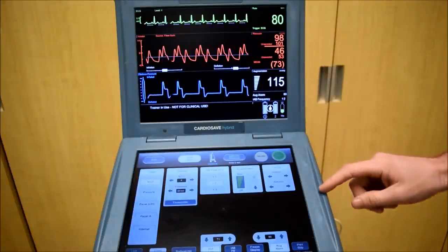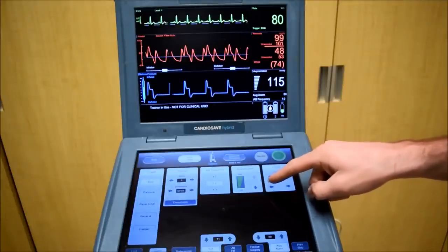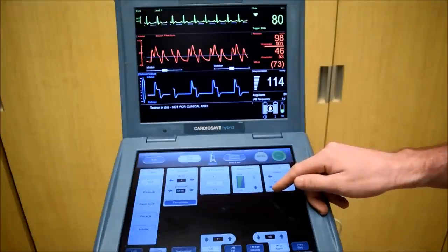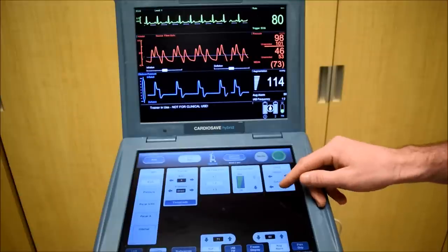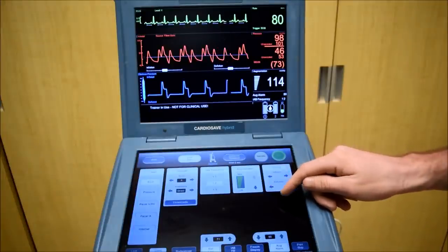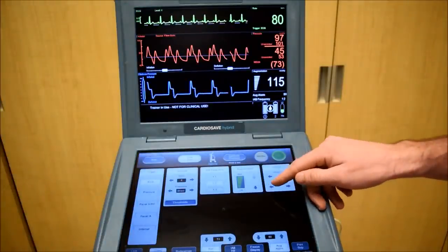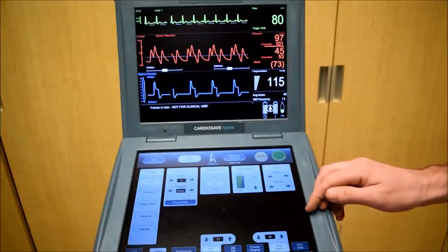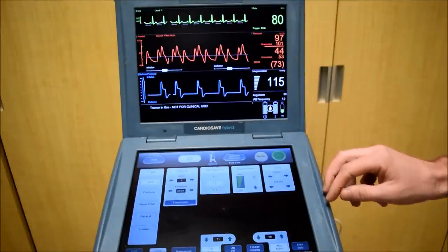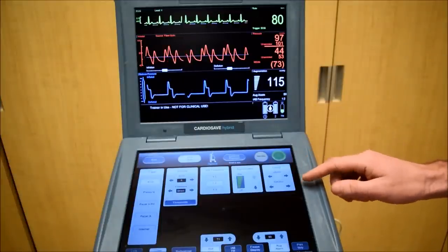We went back up to 46 now, so that means we've gone too far. I'm going to adjust this back until we get back to our 44. Right about there. Now I want to remember that negative 0.5 — that's the optimal point for our deflation timing.